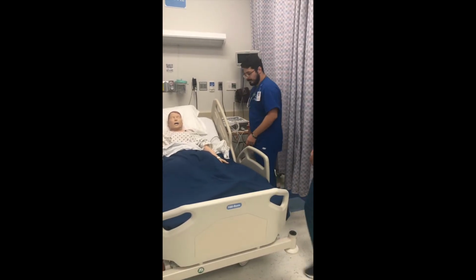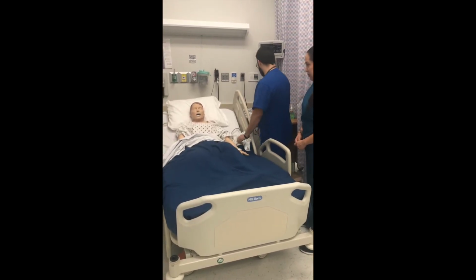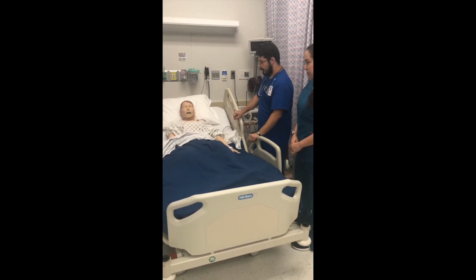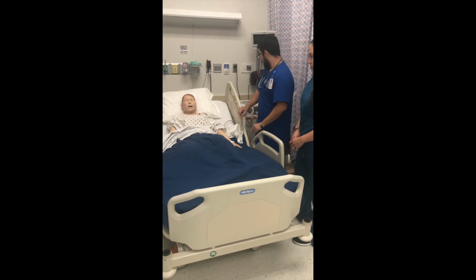Hello, ma'am. My name is Andres. One of the nurses here is my colleague, Tita. Just going to verify your name and date of birth for me. Okay, perfect. Mrs. Zalfar. We're going to be doing an ECG, an electrocardiogram. It's to measure the electrical impulses that run through your heart. It doesn't hurt. It's just a bunch of stickers on your chest and body, so I can use these leads to get my electrocardiogram done, right?